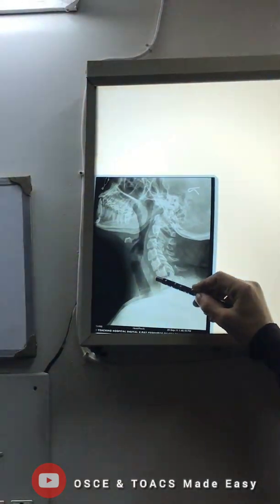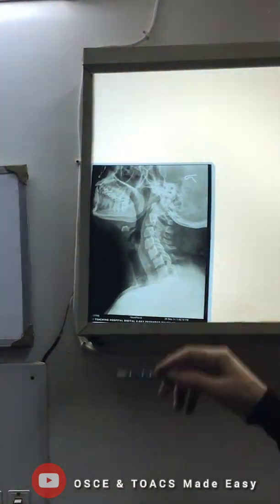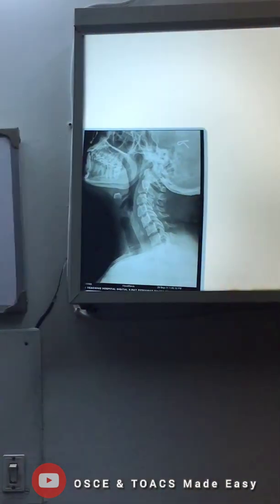The swelling corresponding to two-thirds or more of the vertebral body will appear as soft tissue swelling.